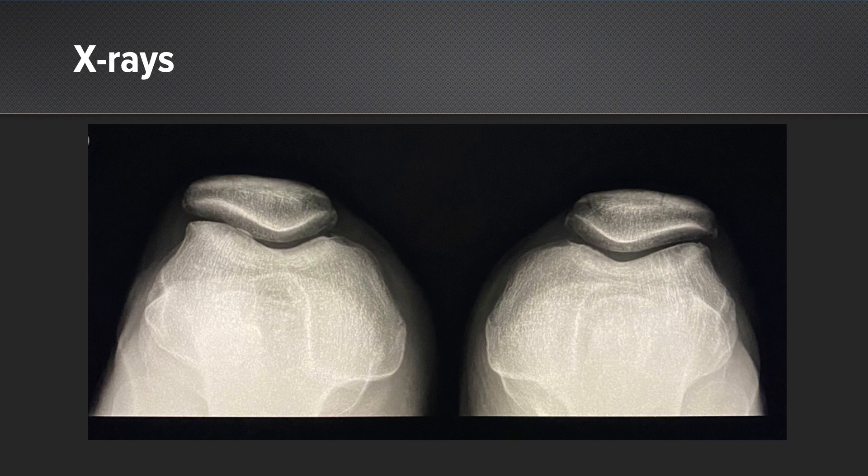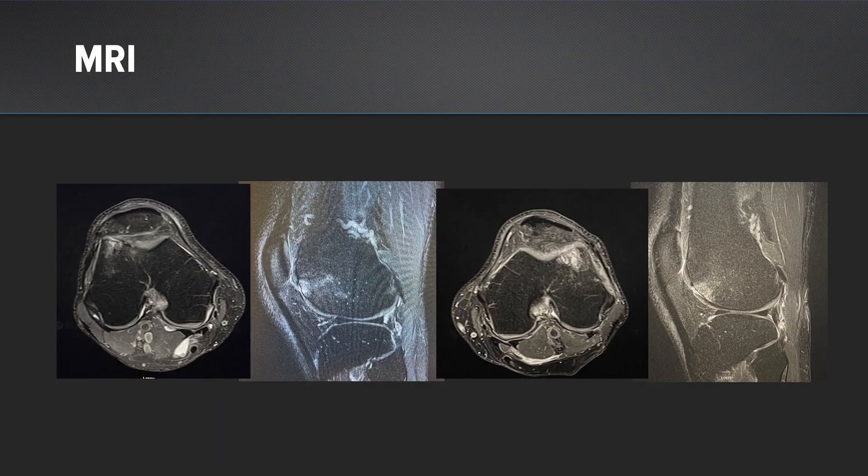On his left knee, you can see a little bit of subchondral lucency along the lateral trochlea. On MRI of bilateral knees, on the right side there are pretty similar lesions. On both sides, you have full thickness cartilage defects with subchondral edema. Along the left side, there is quite a bit more delamination, so that side is going to be a little bit worse for him.